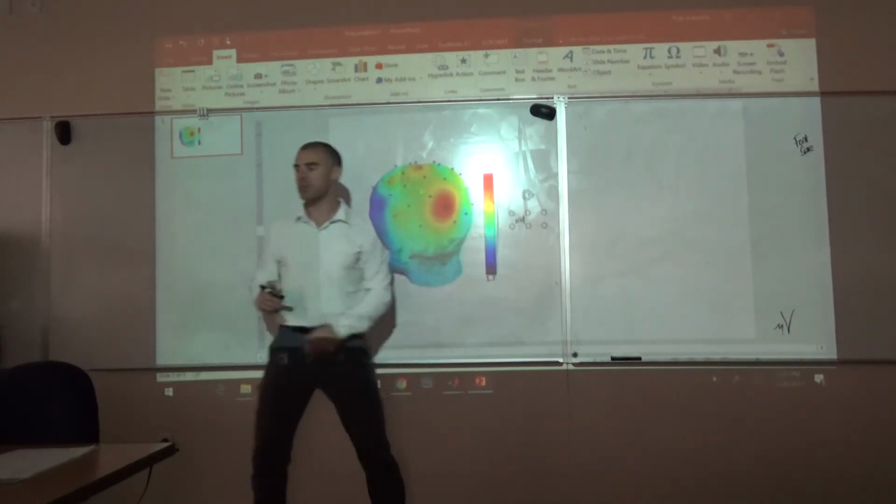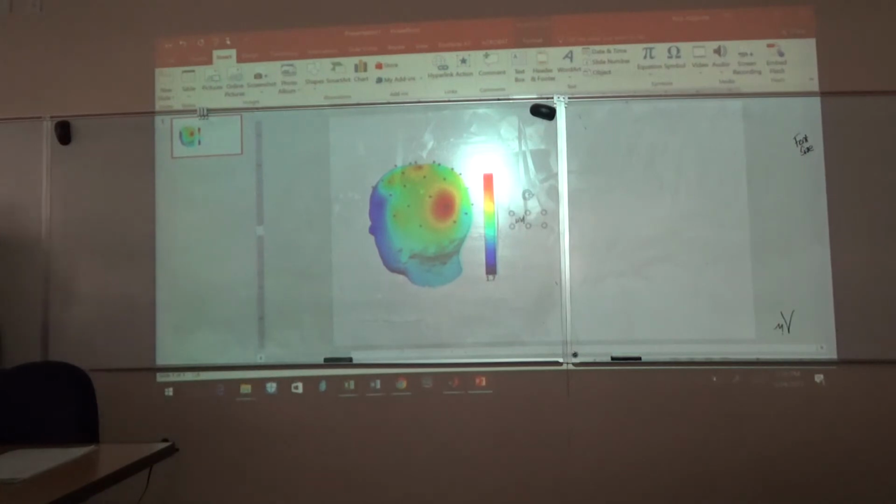And put the big V for volts. Now we can have our label for our axis. And you can put that down on the side here if you want. You can even put it in the green or on the side. Why don't we actually put it there for now? And then give a little spacing, make it look good.